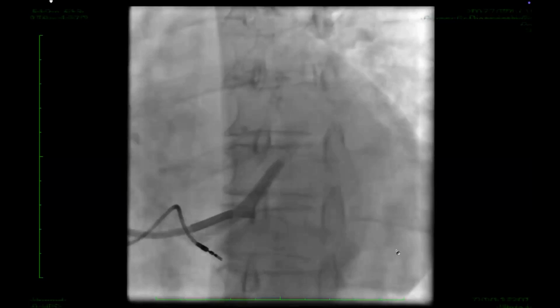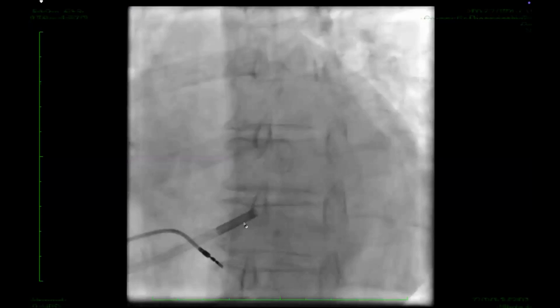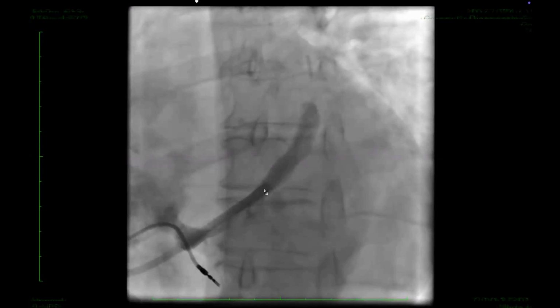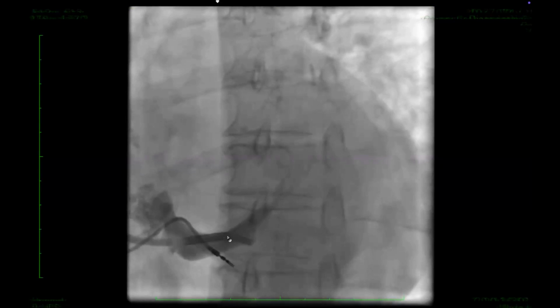And I couldn't. But in order to try and help me, I've used an inner catheter. You can see that there's a difference in shape between this catheter here, the tip here, and the tip there. This is the end of the guiding sheath, and inside that is a 90-degree subselection catheter.